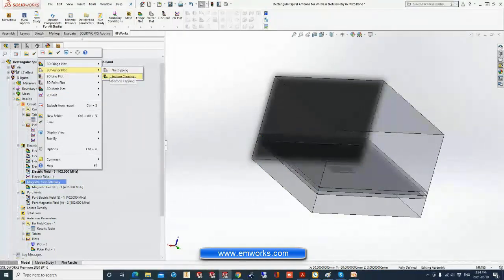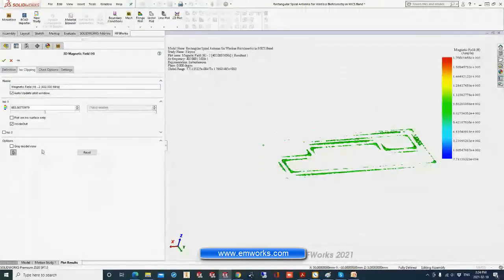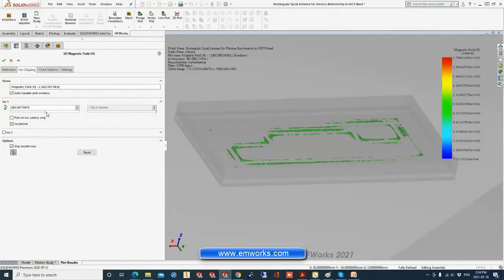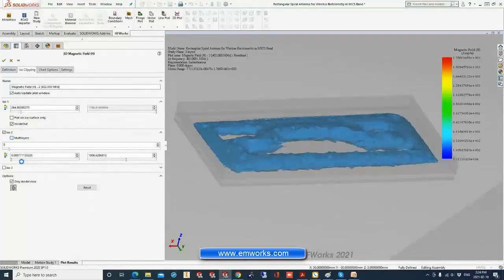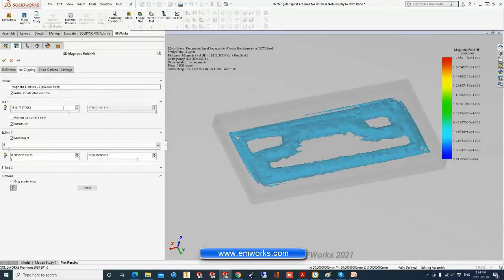It is also possible to detect the location of the highest field by using isoclipping. Isoclipping is a nice feature to see the location of the highest field. You can superimpose it with the gray model. So, for example, you can choose your scale and detect exactly the location of the highest field. You can superimpose, make multiple layers, and choose some values of field just to see what the maximum and minimum field is in the geometry.